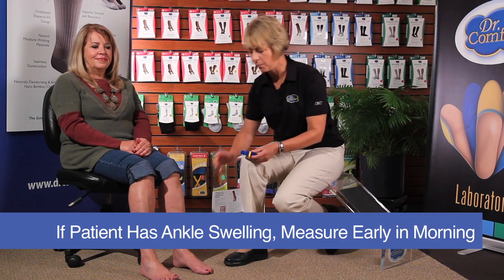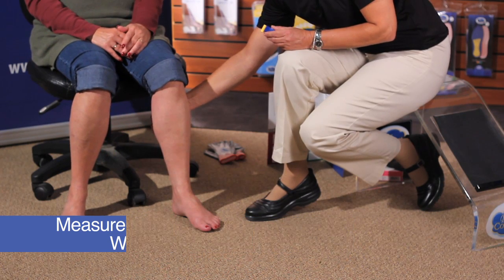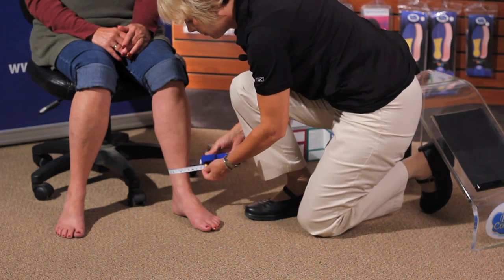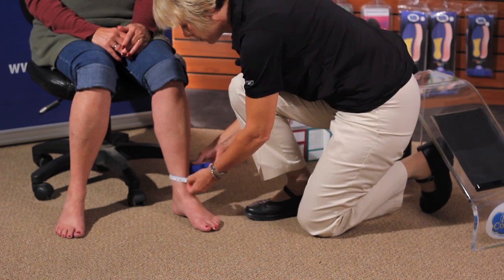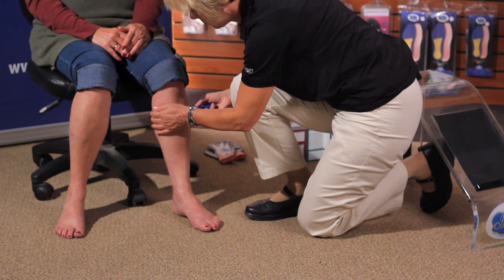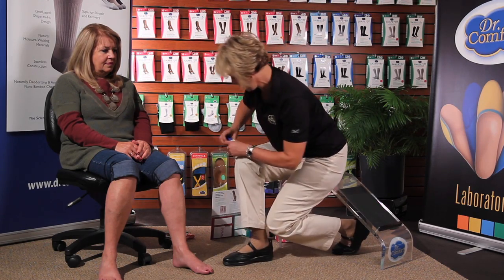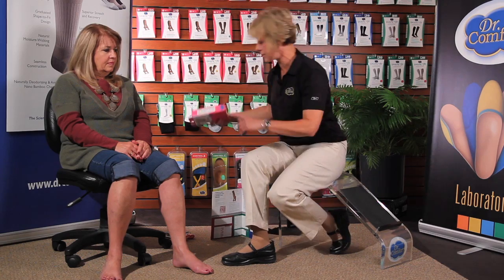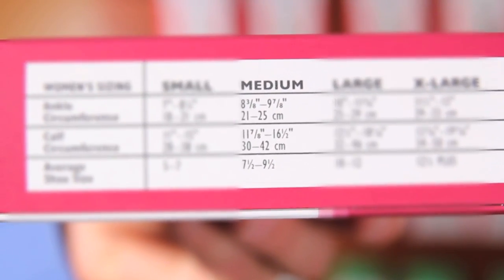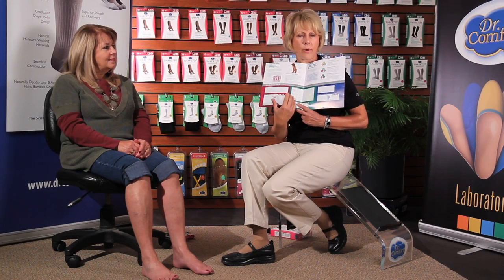When you measure, you want the smallest part of the ankle above the bone and the widest part of the calf. The widest part of the calf can sometimes be found by pushing on the calf muscle. Take your tape measure, measure around the ankle — Kathleen measures nine inches — and the widest part of the calf — Kathleen measures fifteen and a half. Then you can look on your Dr. Comfort Shape-to-Fit box on the side to see the corresponding size. It would be a medium for Kathleen, or you can look in the Dr. Comfort Shape-to-Fit product selection guide.